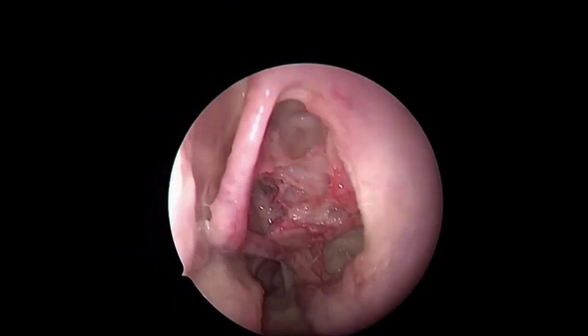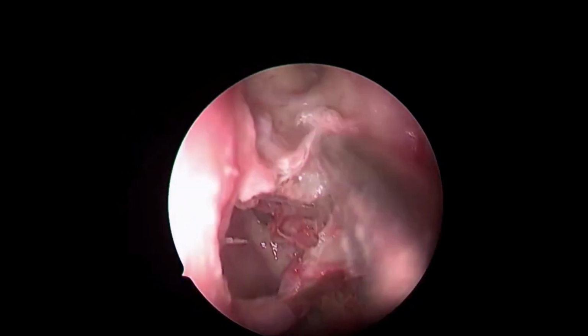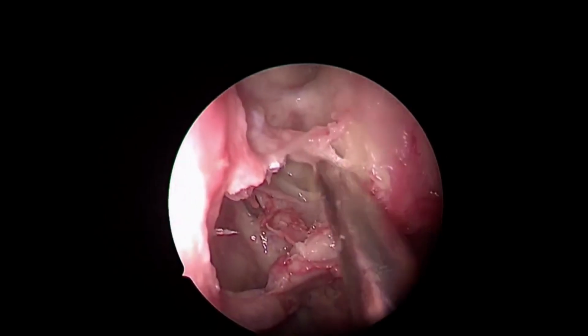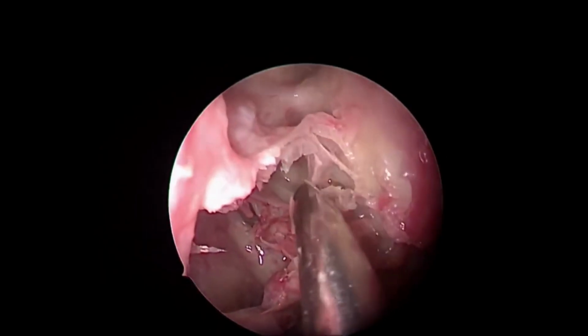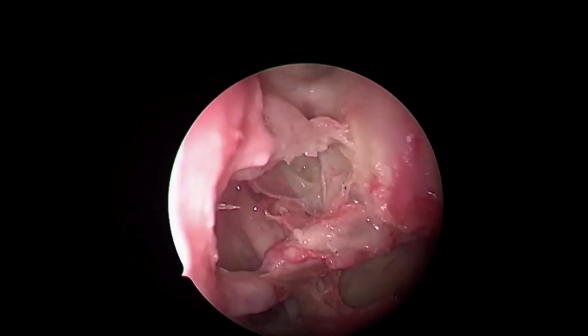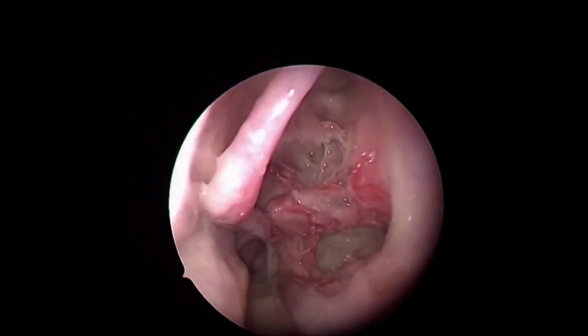Now, having seen this sphenoid sinus, I will carry out my post-ethmoidectomy. See this? Again, I reiterate the same words I still remember from Dr. Ashish Bhumkar, 2006. This post-ethmoid is again like a box.